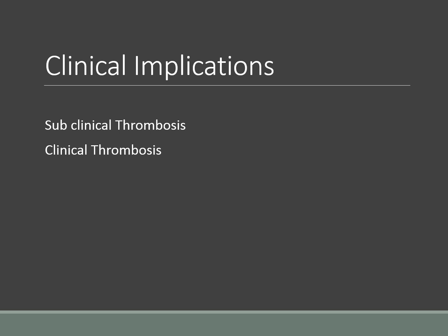On the other side, if CT is able to identify leaflet thrombosis with restricted movement of the TAVI leaflets, this indicates a case of clinical thrombosis, and this patient should receive anticoagulation and of course be arranged for follow-up echocardiography to show the pressure gradients along the TAVI, and CT to identify the progress or regression of the hypoattenuation along the leaflets.